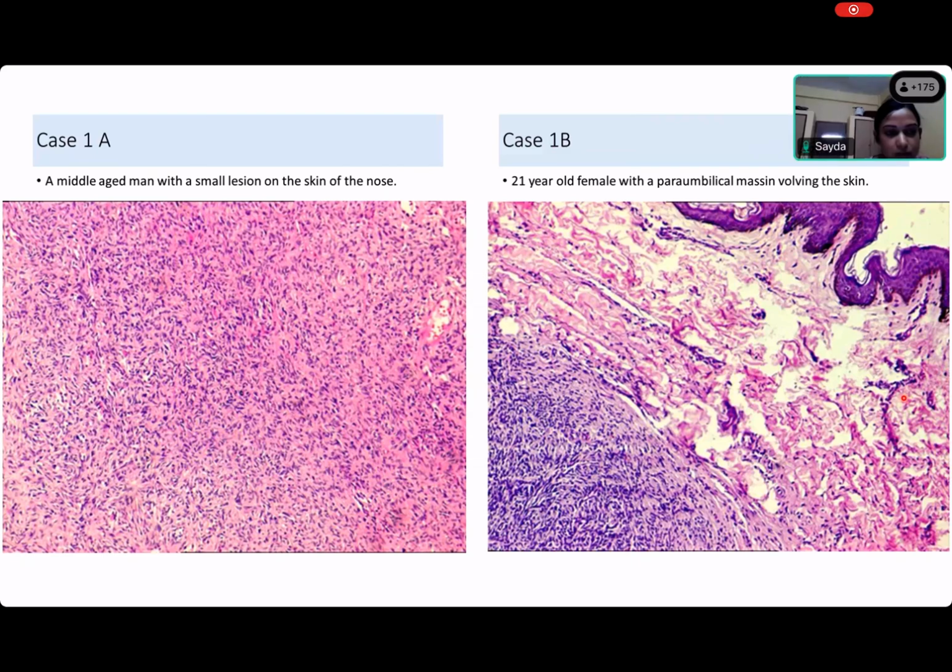We discussed how we have to go about it, right? Yes, ma'am. So observations first. Ma'am, in the left side of the slide, in the lower part, it shows bland, small spindle cells in a concentric pattern with numerous blood vessels. Concentric pattern. Now, did we discuss any concentric pattern, Saida? What is a concentric pattern? Can you give me an example of a concentric pattern?